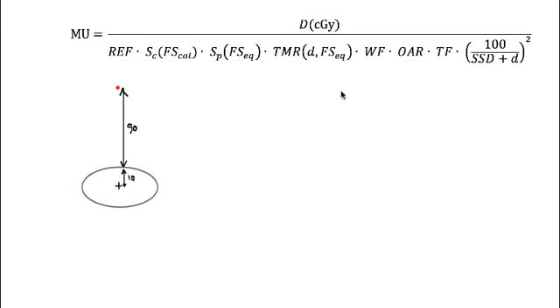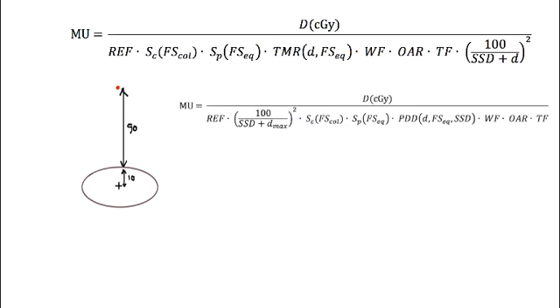All right. Now, one final thing that you might want to think about is that we're using TMR here. But remember, I talked a lot about PDDs. So can you use PDDs? And the answer is yes, you can. And here is the formula. So here you can see that TMR has essentially been replaced by the PDD in this formula.